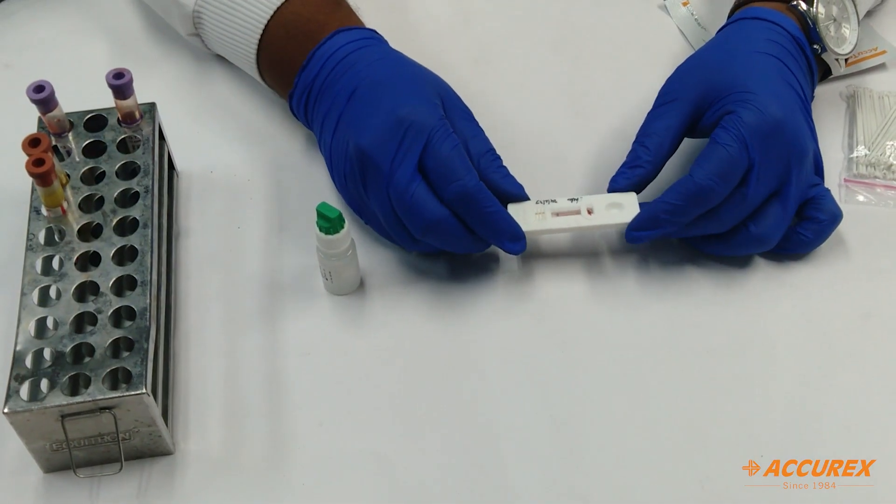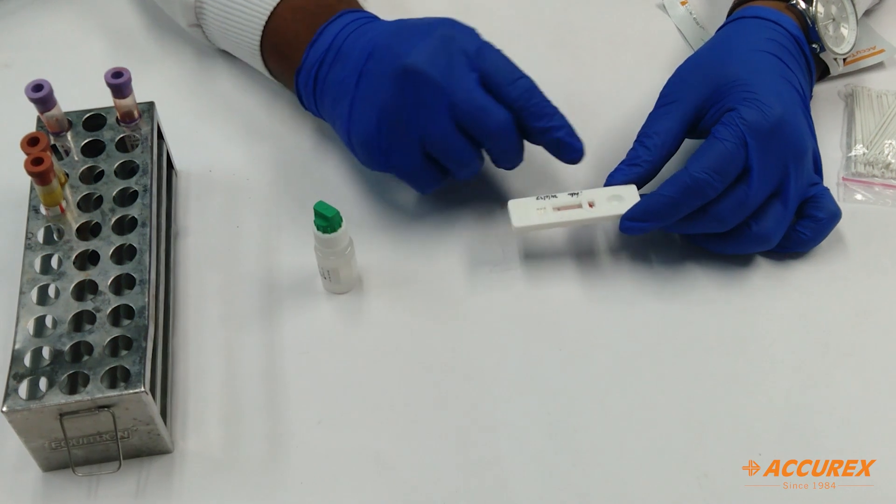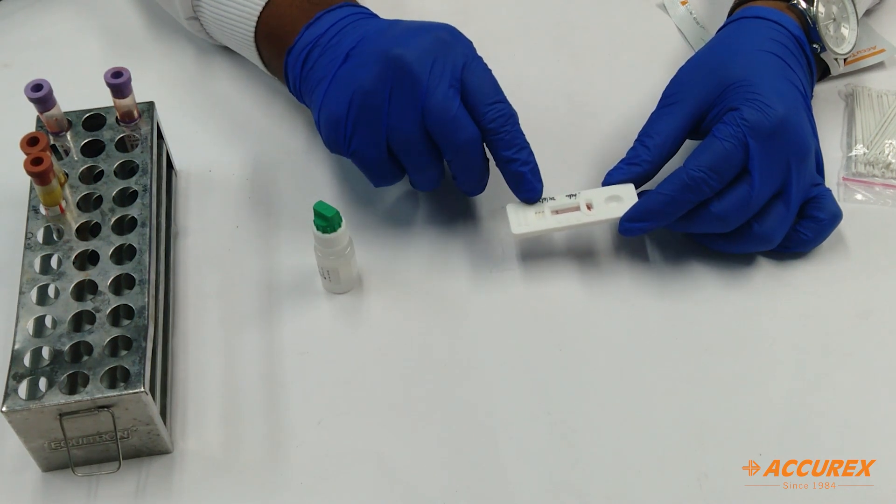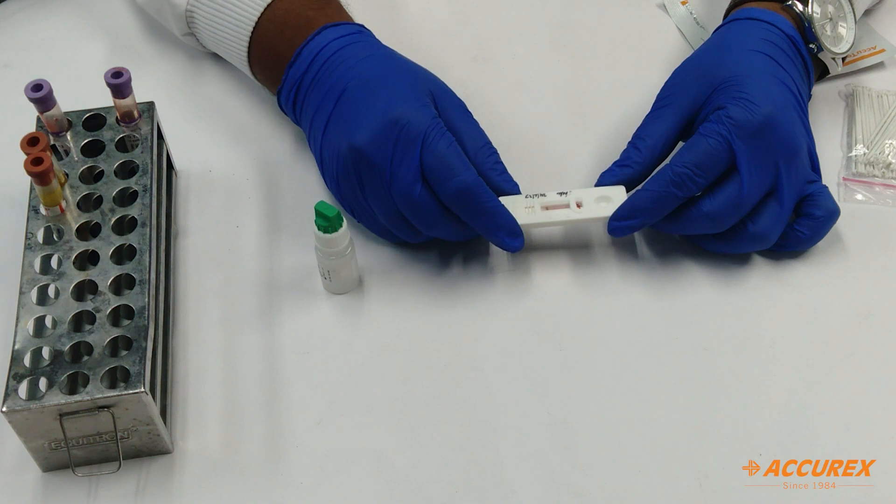So now I added the buffer also, four drops. So you can see the flow has been started. So it will take 15 to 20 minutes to get the results.